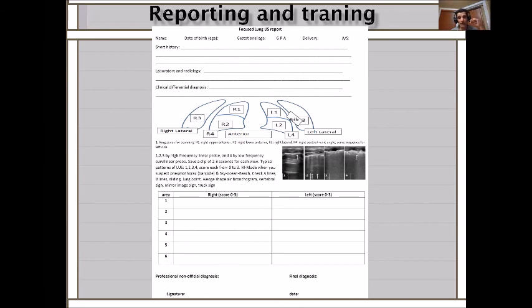You can diagnose allergy, cow's milk allergy. You can use it for gastroenteritis, for ischemia and for necrotizing enterocolitis. You can use it for ileus and pleural effusion. You can use it for the heart and you can use it for procedures. So it's not only for the lung. You can learn more echoes, especially the heart, cardiac and bowel.